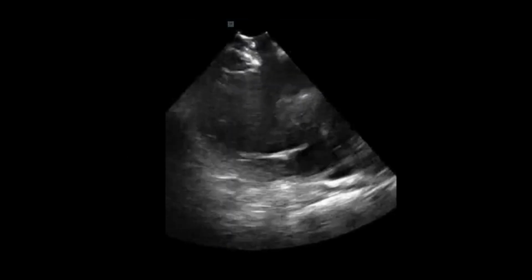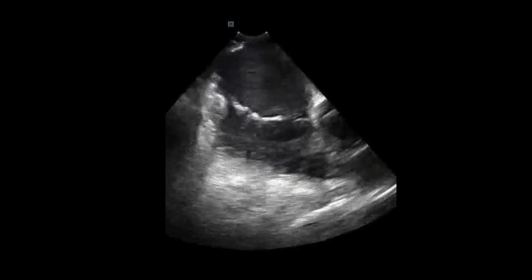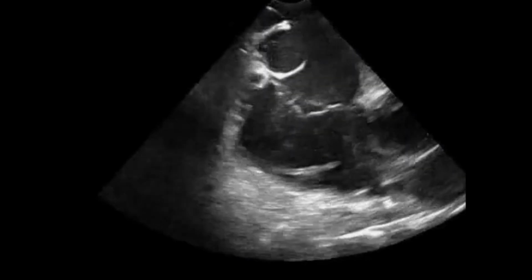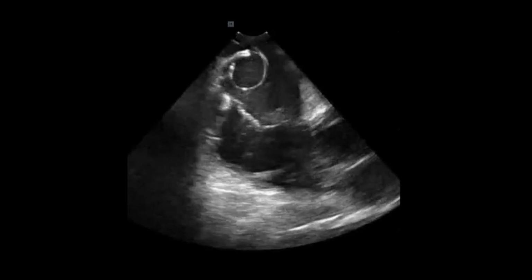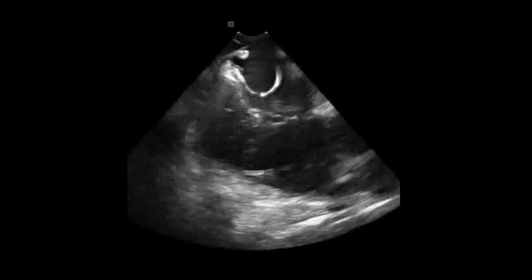Here, this is another patient with a eustachian valve, and if you notice, that area is going to be very hard to ablate if we don't have ICE to recognize it. So what we can do again, usually, is perform a U-curve and bring the ablation catheter tip right under that eustachian valve to be able to have a successful ablation of the cavotricuspid isthmus. So we see that we have very good contact to that part of the eustachian valve.